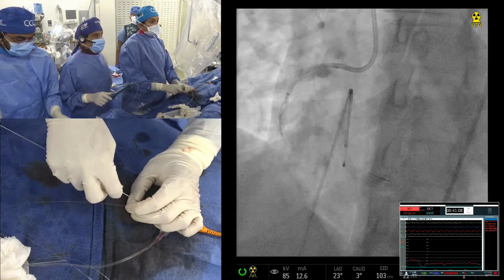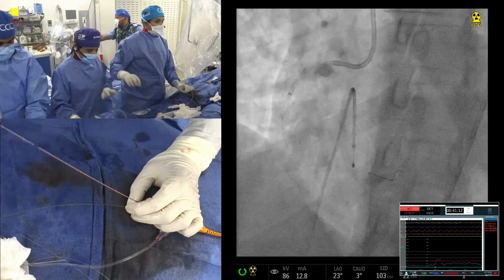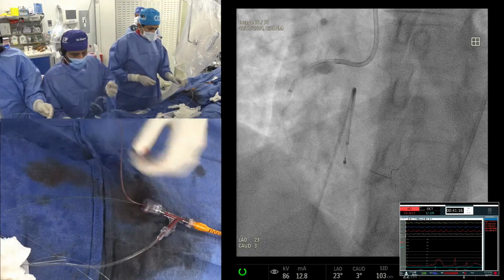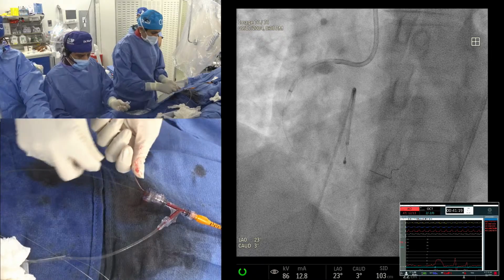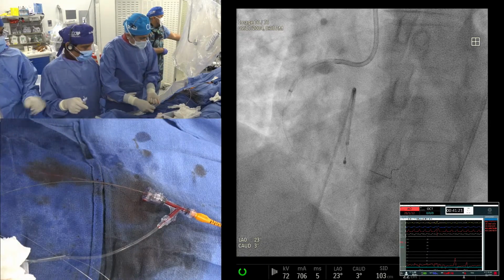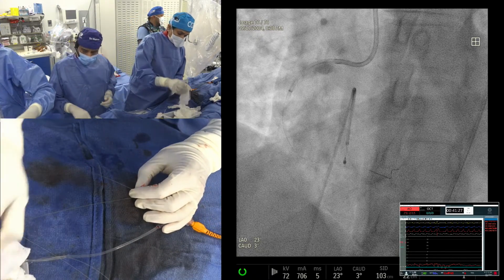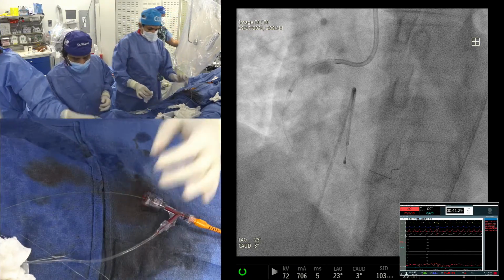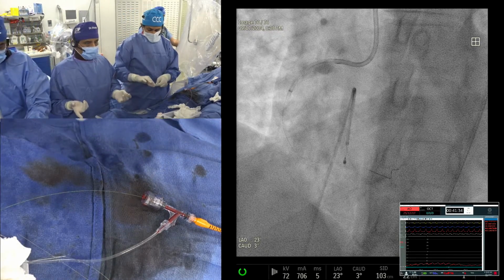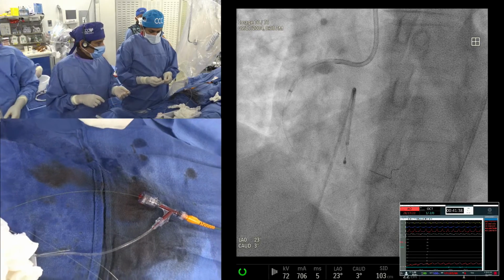So I think one device. Now the question is, could it be orbital? I think so, but the only thing is, in tortuous lesions I'm still a little skeptical. Even using a ViperWire Flex, which is a little hydrophilic and should be a little better, we have seen some cases where it doesn't give you support. The orbital burr, we call it crown, does not even cross. So I'm a little concerned. Because of tortuosity, the single device here is rotational atherectomy. You don't need anything else. Non-compliant balloon followed by IVL.